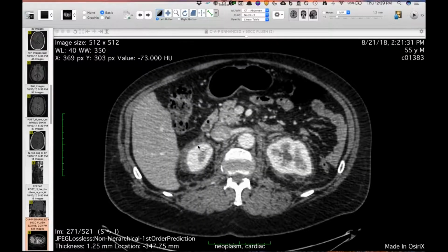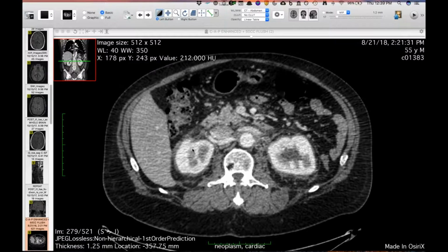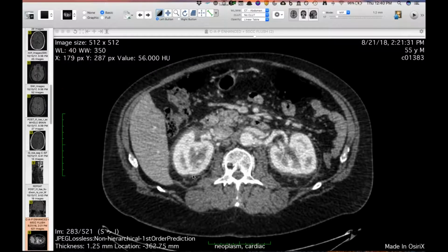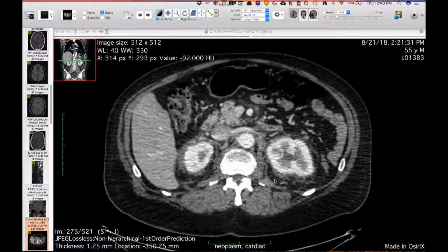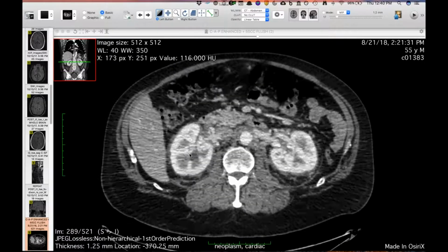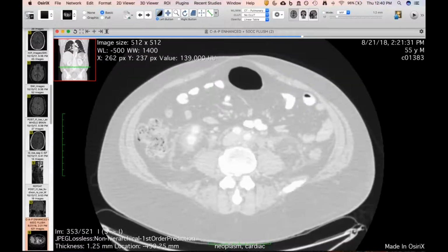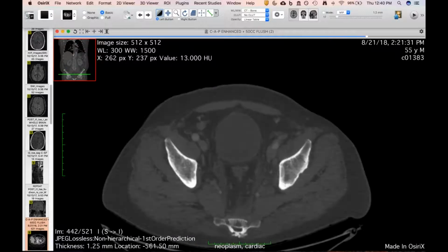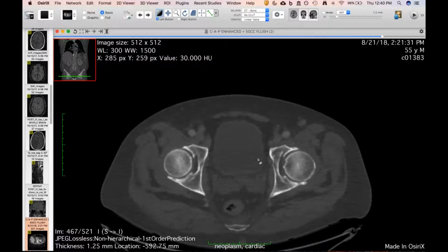And then I saw this, and all of a sudden, as you would imagine, my tune instantly changed because now we've got this symmetric infiltrative soft tissue surrounding the kidneys. And so now we're thinking Erdheim-Chester, and really, not much of a differential, I think, at this point when you combine those two, as we've seen cases where it involves the heart, the aorta as well.